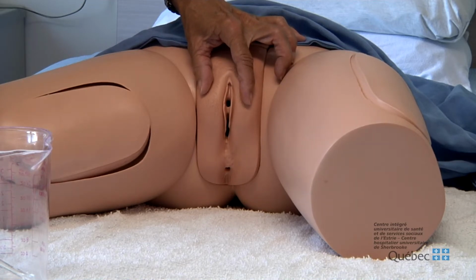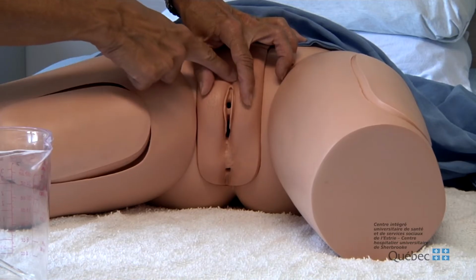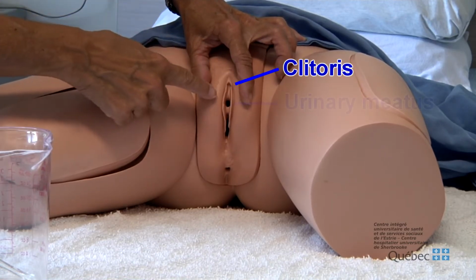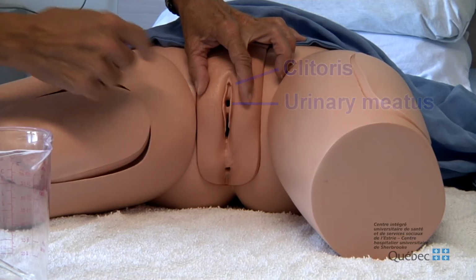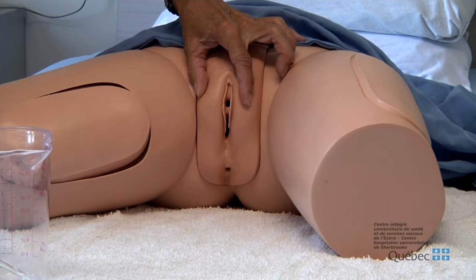Use the index finger of your free hand to locate your clitoris. The urinary meatus is located just below the clitoris. If you need to, use the mirror to help locate the urinary meatus.